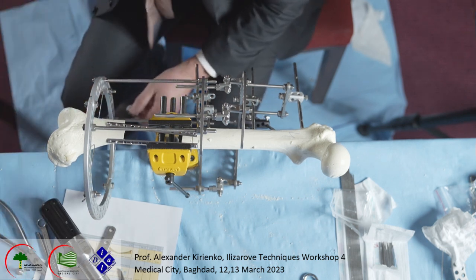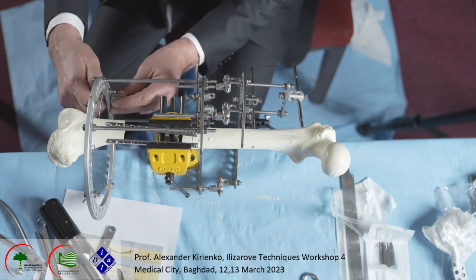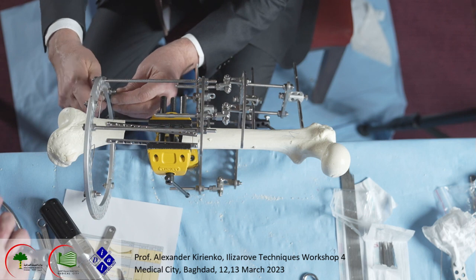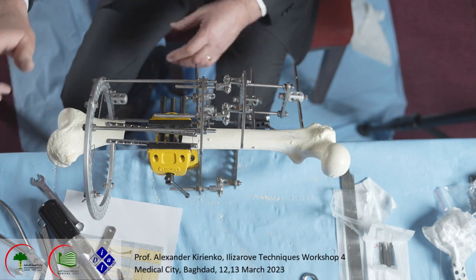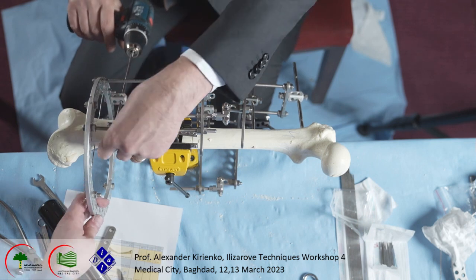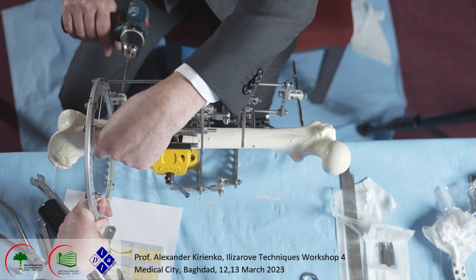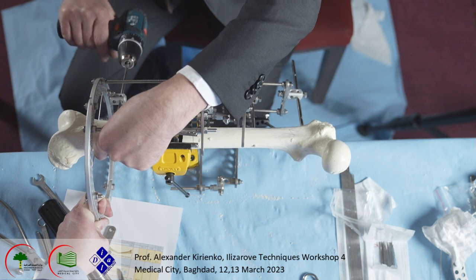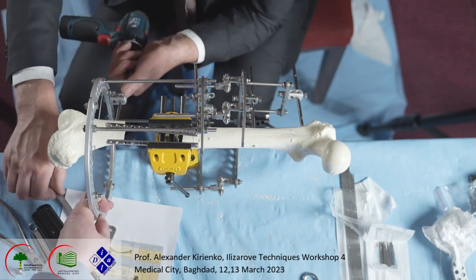Another small bolts maybe you have. Okay, half pin. One here. And the same principle here. When you put the half pin, you go through the fascia, the posterior part of the fascia.